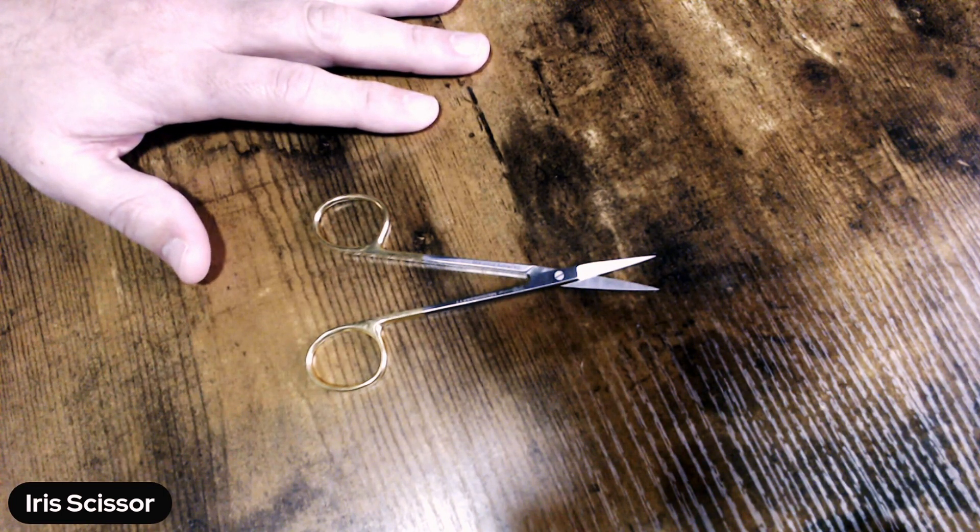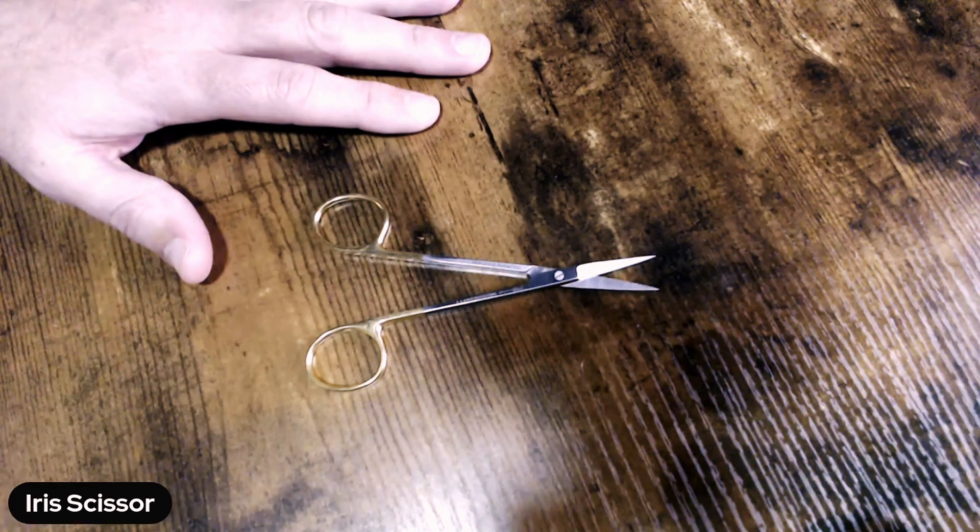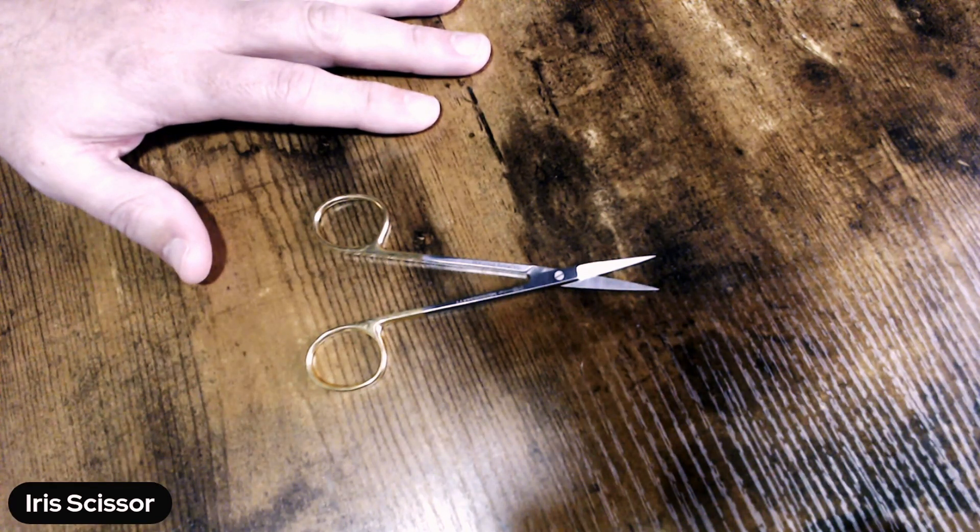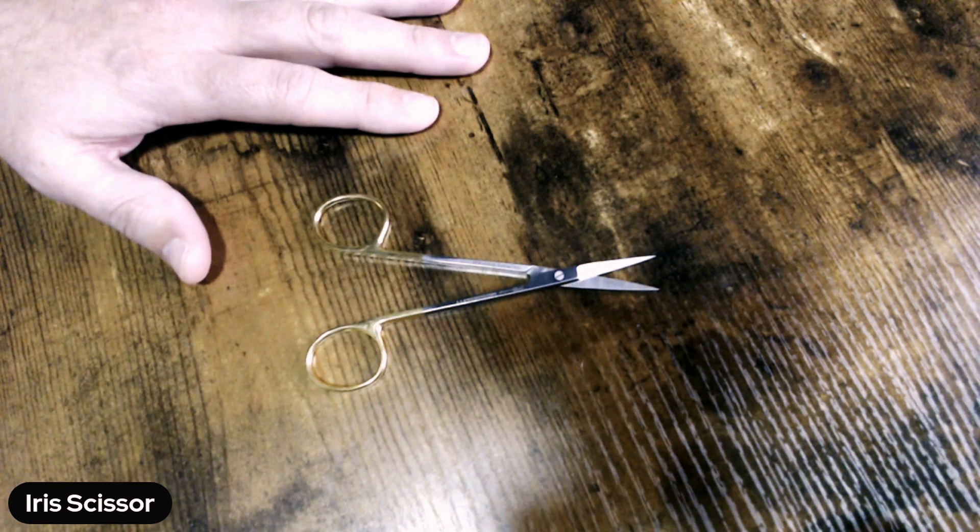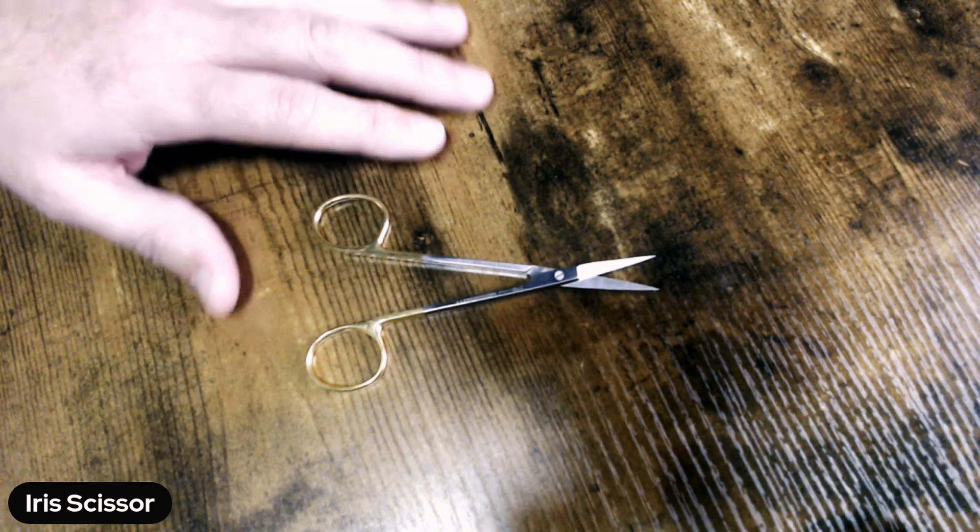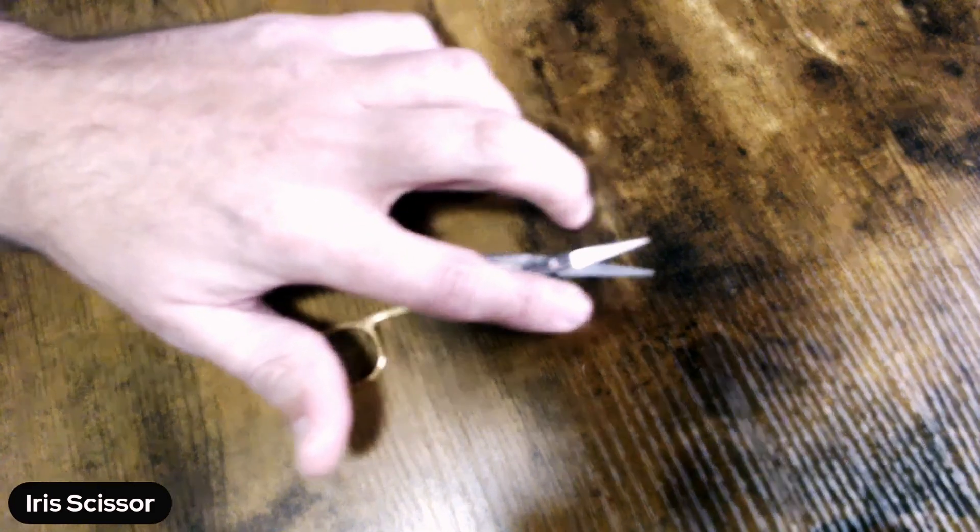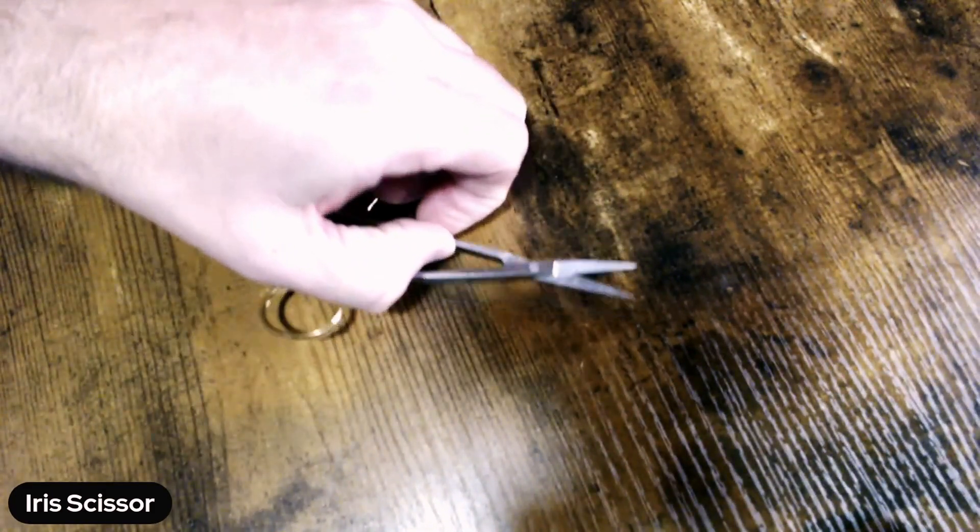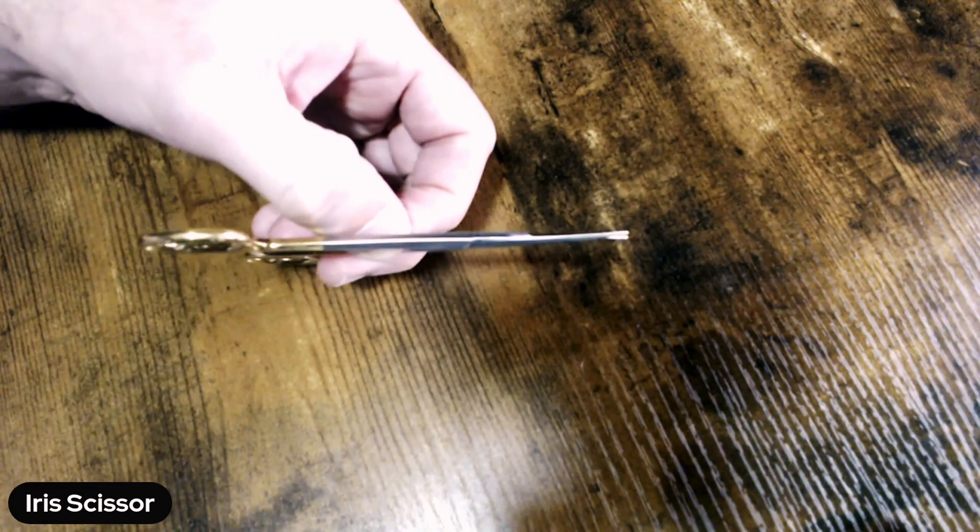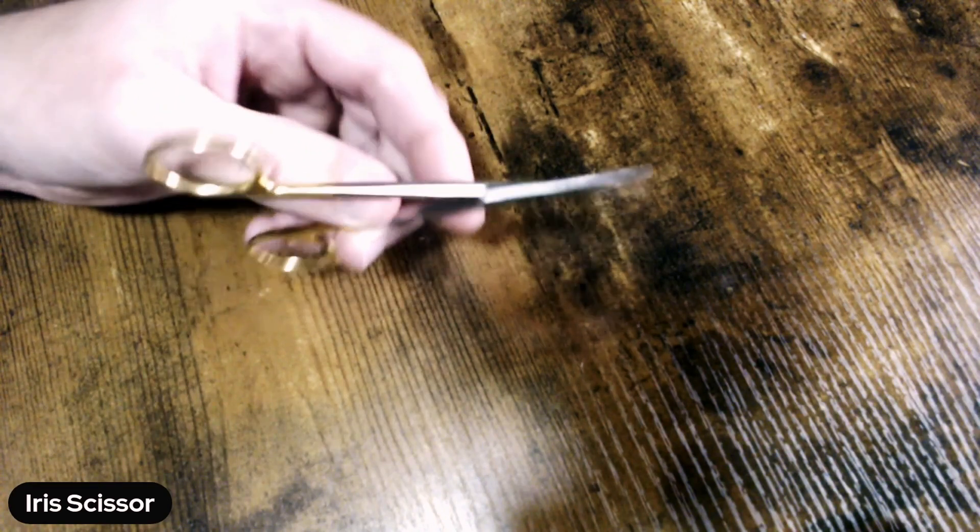But keep in mind there are different variations of iris scissors out there that are common in your surgical tray. I may not have mentioned this is also a straight iris scissor that you can observe from the blade angle. There is no angle, so that's a tip-off that you're looking at a straight.